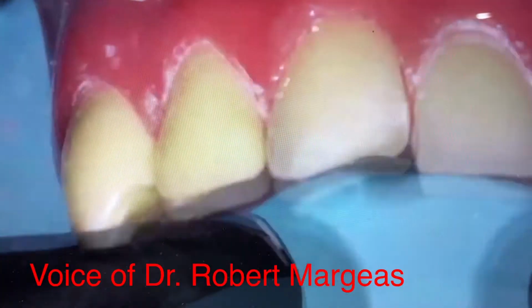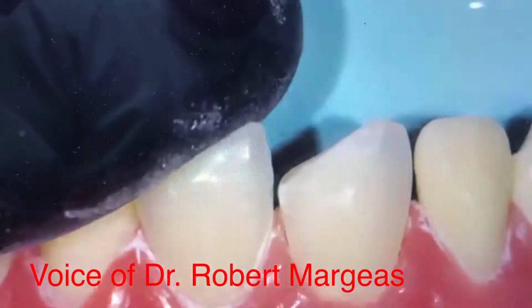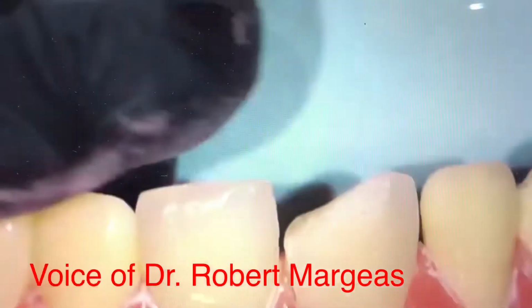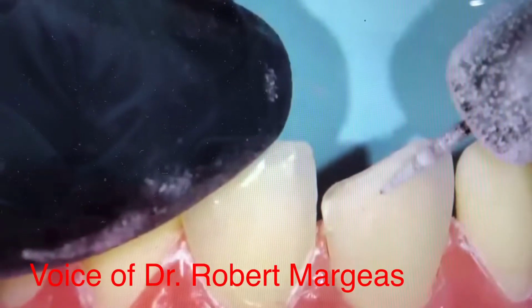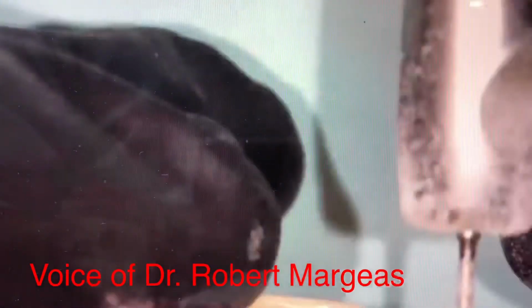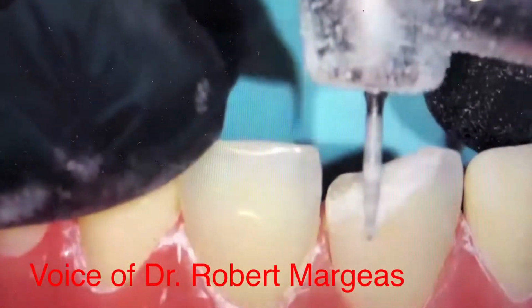All right. It kind of disappears. It's almost like a disappearing bevel. And I want to show you up close here. This is where the bevel is, right here. So from the fracture line, it's a couple millimeter bevel. I want to make that just slightly deeper here.